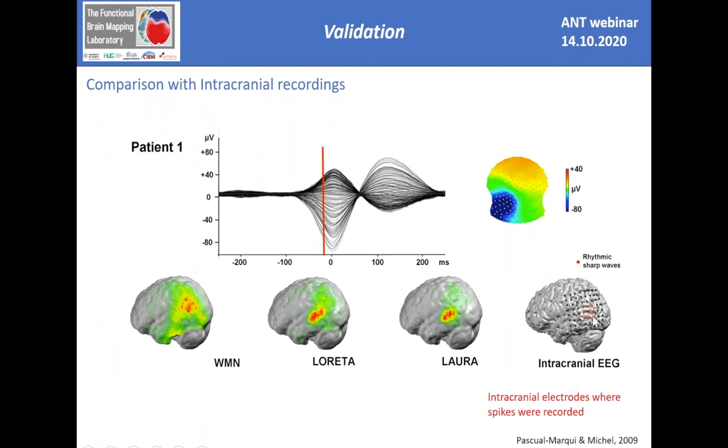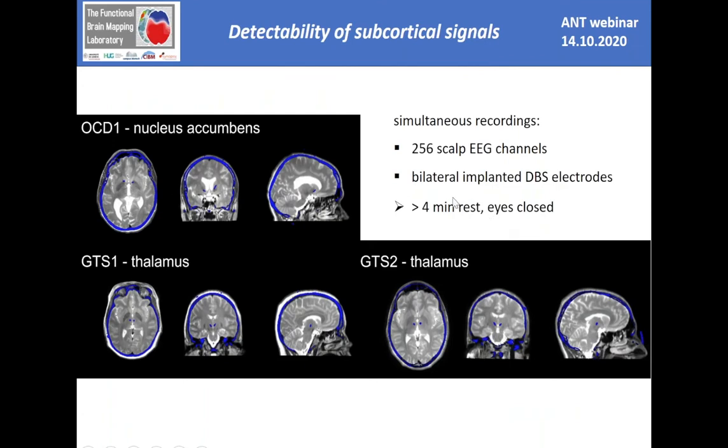Here we had intracranial and non-invasive recordings, and we can just compare the intracranial localizations of the electrode grid and look where the spike was maximum on which electrode, and if the source localization coming from the non-invasive data is closest to the invasive intracranial EEG, then we know, okay, this is the most accurate or the most correct, right? So here we have a direct comparison because we know the ground truth in the brain, but then we have this non-invasive reconstruction when we compare both of them. And this is a very recent example, discussing a bit more in detail.